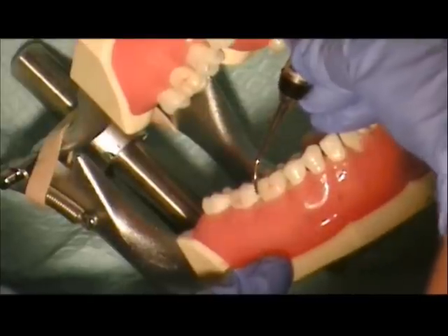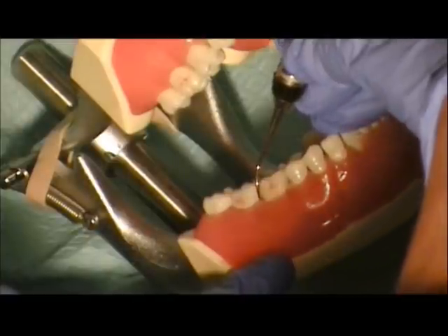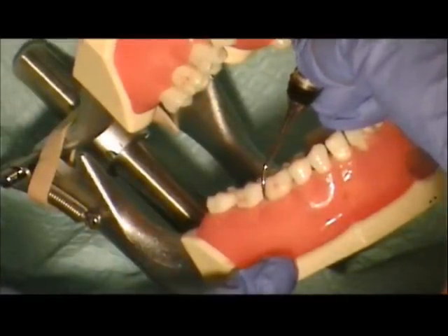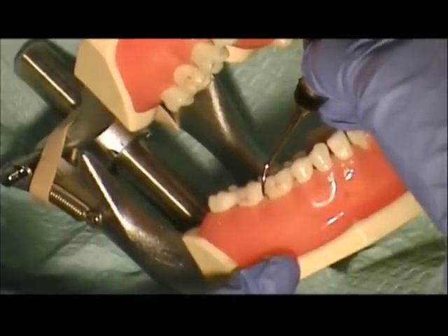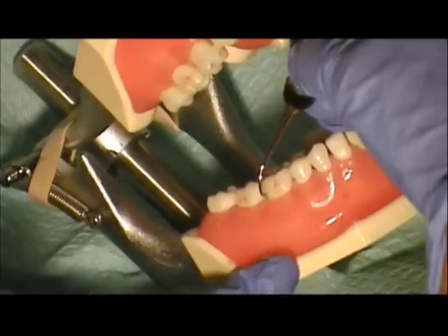We place the posterior sickle at the distal line angle, eyeball to 90 degrees. We need to tip the face towards the tooth to get to our 70 degrees, and simply lift with small 1mm strokes.